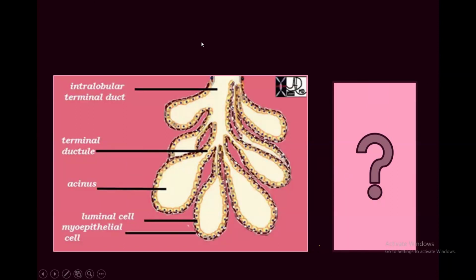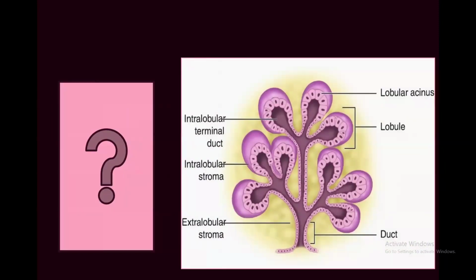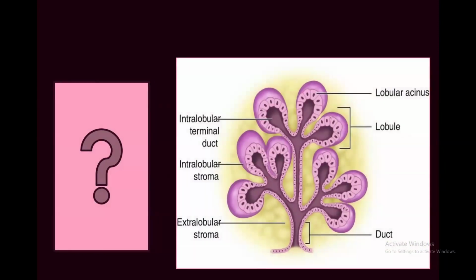No. Which one? So here? Yes. What is this? Terminal duct lobular unit. Okay, and this? And what is the difference between the two? Also terminal duct lobular unit.